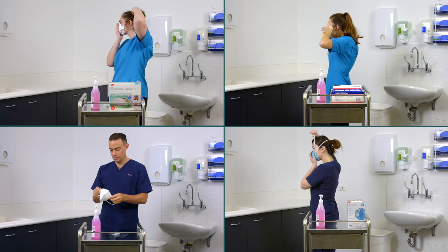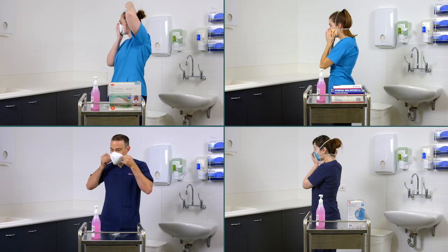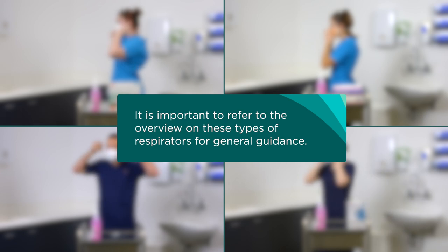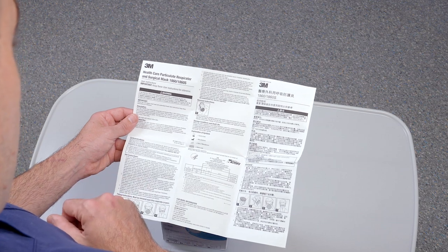This video is part of a series on donning and fit checking P2 or N95 respirators in New South Wales healthcare settings. It is important to refer to the overview on these types of respirators for general guidance. This video does not replace the need to check the manufacturer's instruction for use.